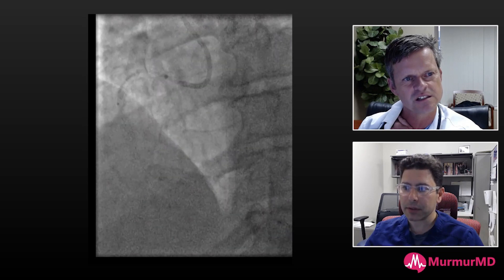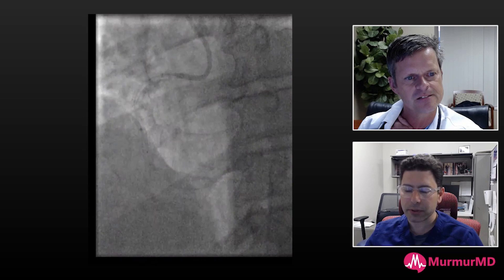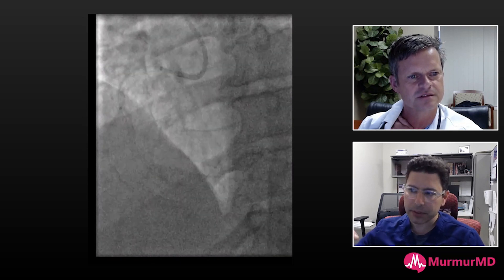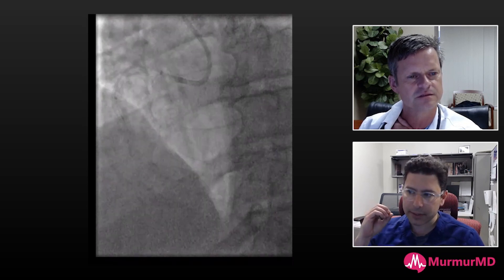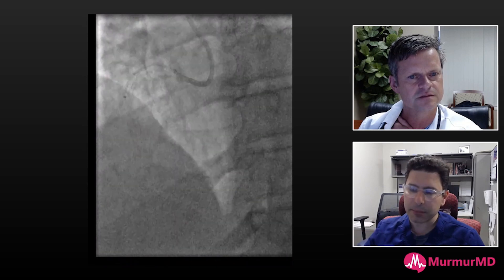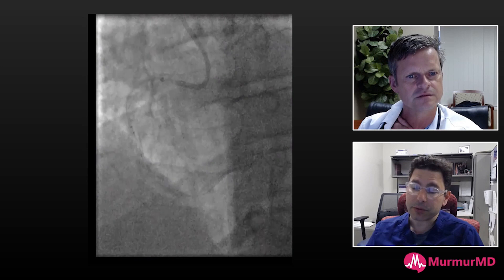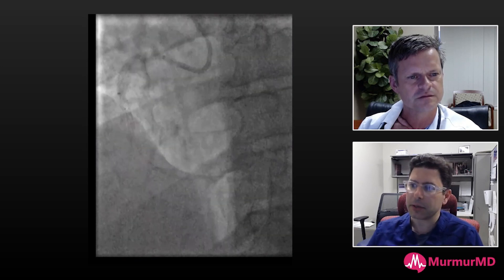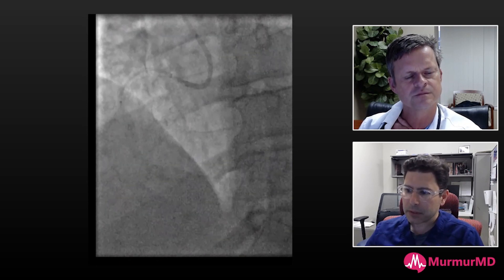I underestimated the length, so I wanted to be as short as possible from a stent standpoint and prep the smallest segment I could to deploy a stent. Unfortunately I ended up in the middle of plaque — I was trying to avoid going with a long stent through this tortuosity, and I paid the price for it.